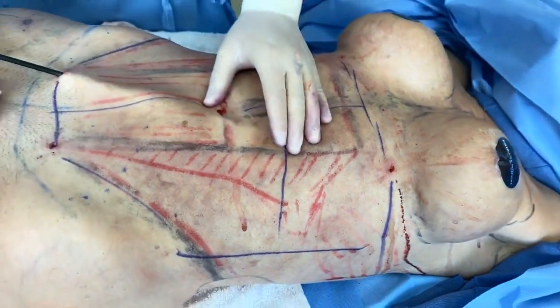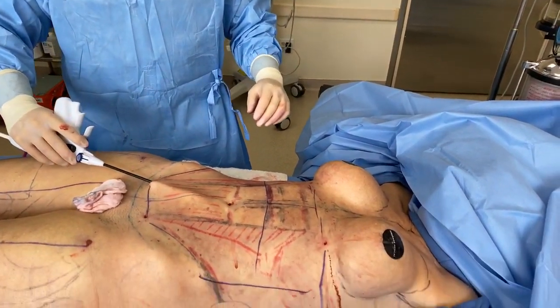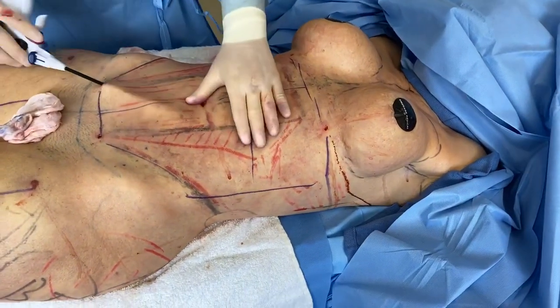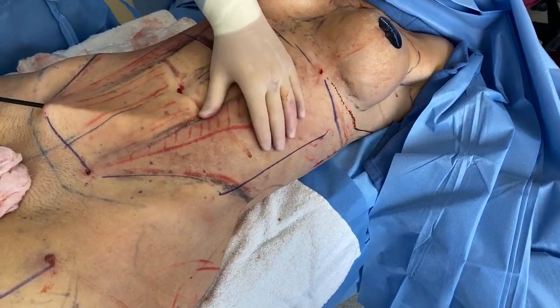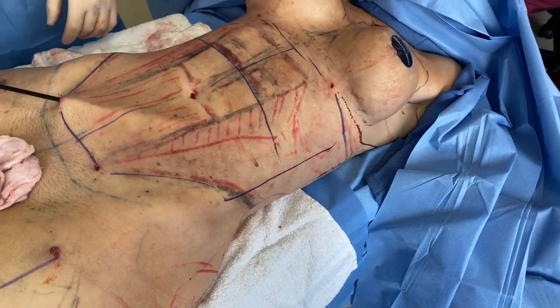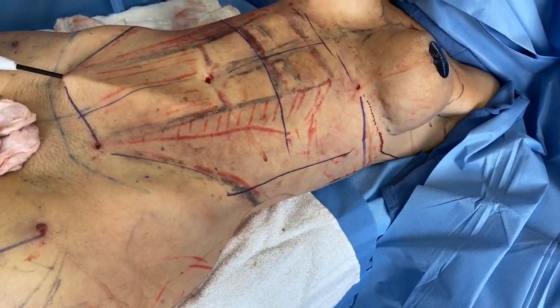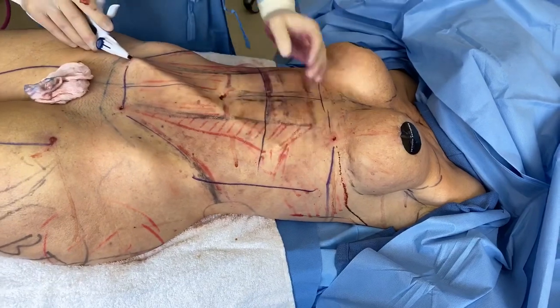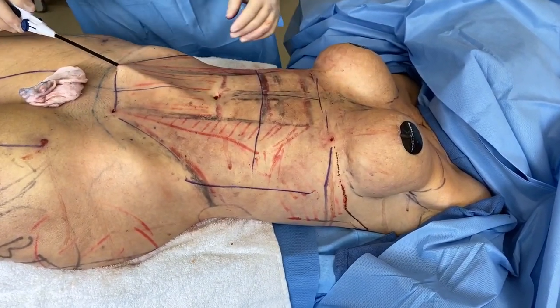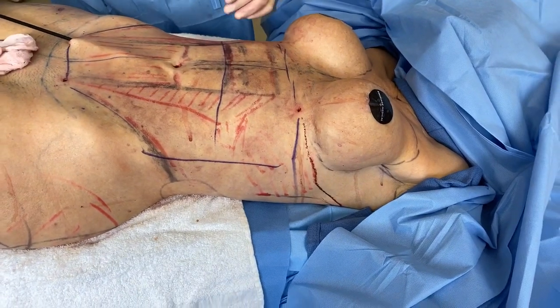She is definitely going to be a ripped, hot mama — I can't even tell you how good she's going to look, especially for her age and being how lean she is. Very few doctors can do that — supermodel lipo — which is what we're doing here: very thin women who just want more tightening.